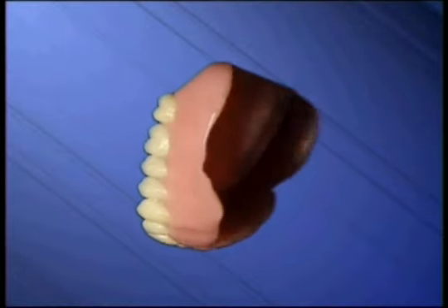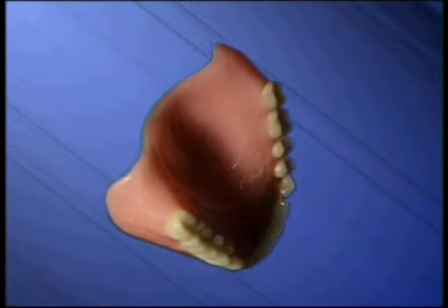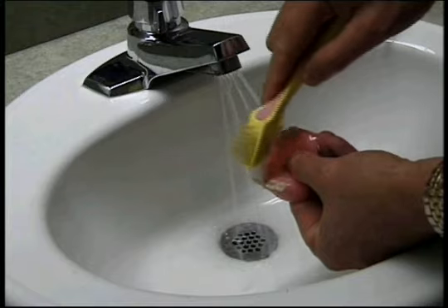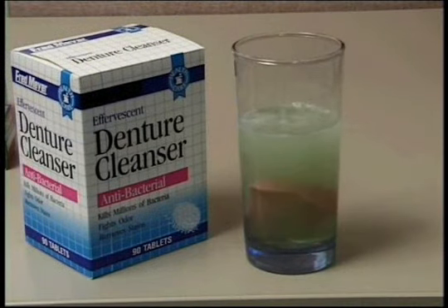Dentures, like natural teeth, must be kept free of plaque and tartar. This prevents permanent staining and bad breath. Use a denture brush and one of the many commercial cleaning products to thoroughly clean all of the surfaces of your denture at least once a day.